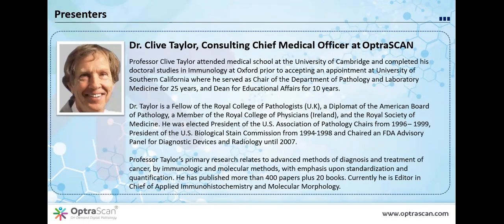So here we have the presenters for today. First, it's going to be Dr. Clive Taylor. He's the consulting chief medical officer at OptraSCAN, and Dr. Taylor has been with us for a very long time. And today it's my honor to be presenting with him.